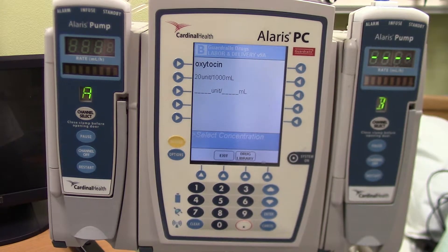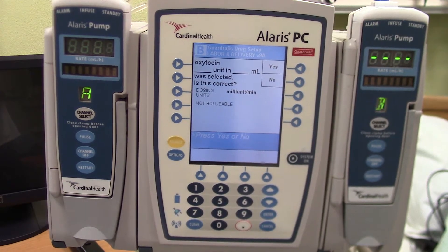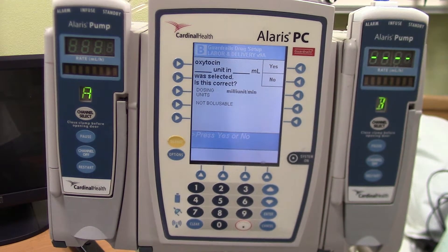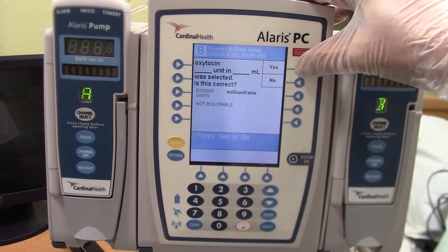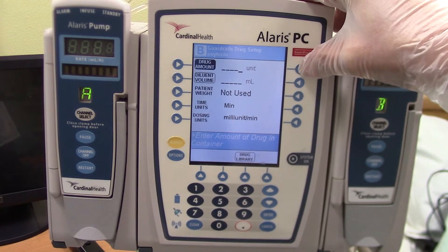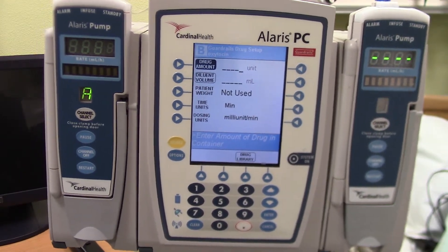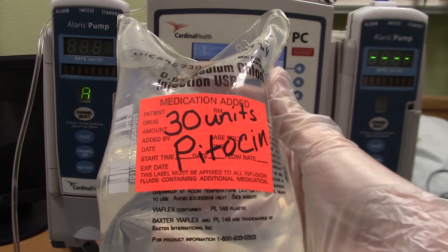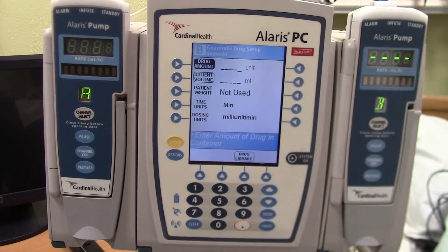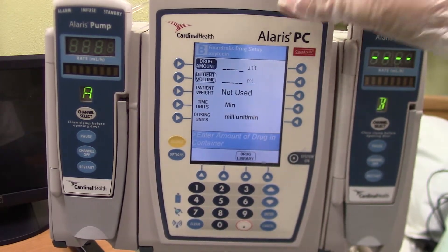I have a couple of options here. It asks me, am I using a mixture of 20 units and 1000 milliliters? Or do I need to tell the pump what concentration I have? I need to tell the pump the concentration I have because I'm using 30 units of Pitocin in 500 milliliters. It's going to ask me to verify that — do I indeed want to program the pump telling it how many units and how many milliliters? Yes. So the drug amount now — I'm going to look again at my bag and verify I have 30 units of Pitocin in 500 milliliters. This is also a good time to recheck the MAR and make sure that we are doing this correctly.